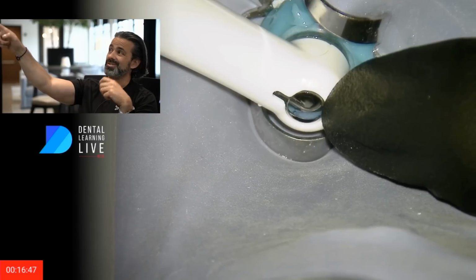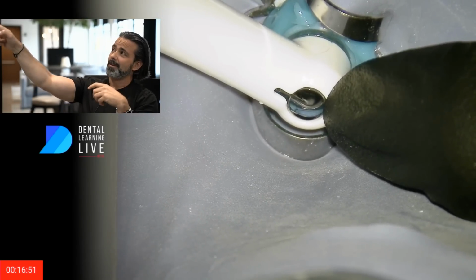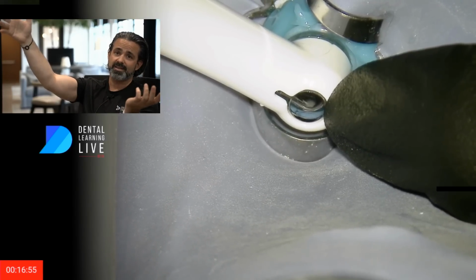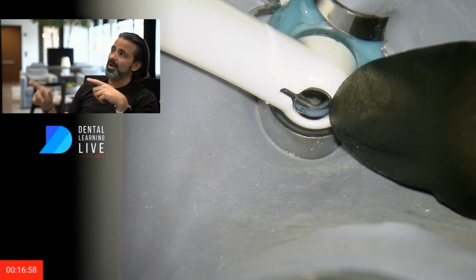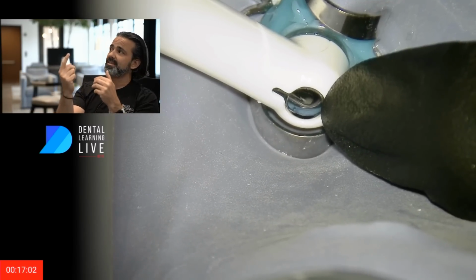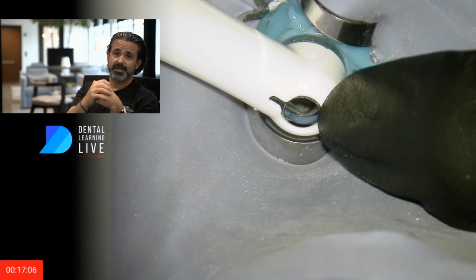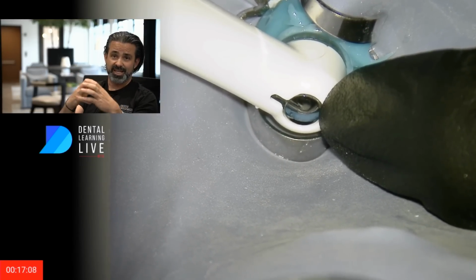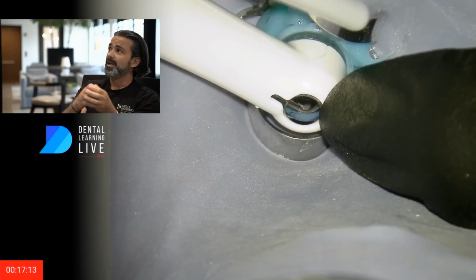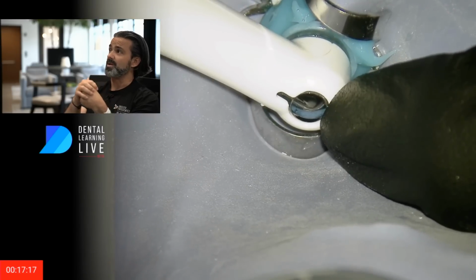Now, if you look at it, you'll see my thumb now holding because it's more convenient. I'm just using the tip of my fingernail. It's not like I'm putting a lot of force on it. But it also lets me see the window and make sure that vent is open. So fluid dynamics takes place, creates the vortex in the handpiece, the procedural instrument, and that's where the negative pressure is, the engine is, which is why my mind wants to keep it right up above that orifice. And then the chemistry is going on in there because it is hypochlorite, after all, running through this.